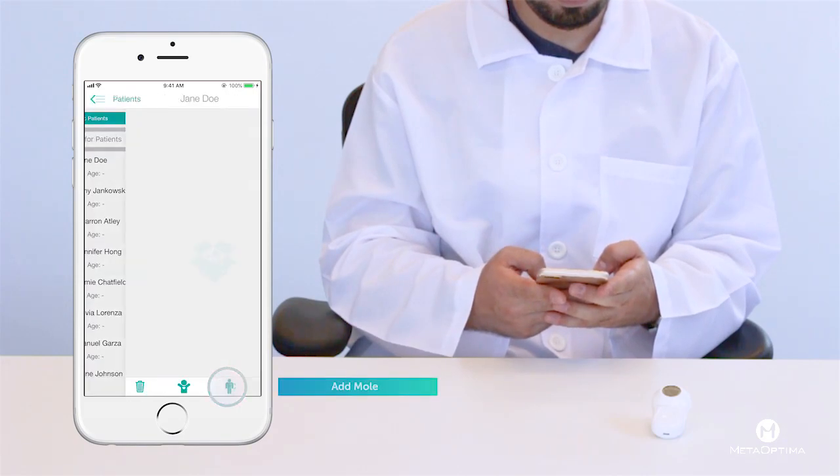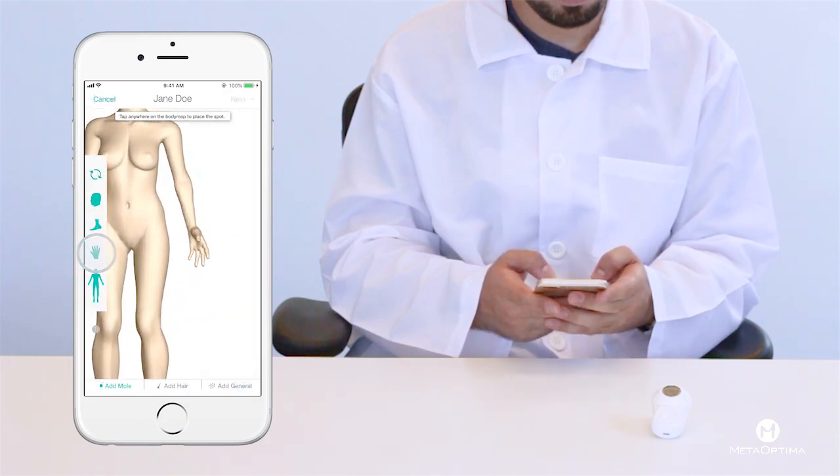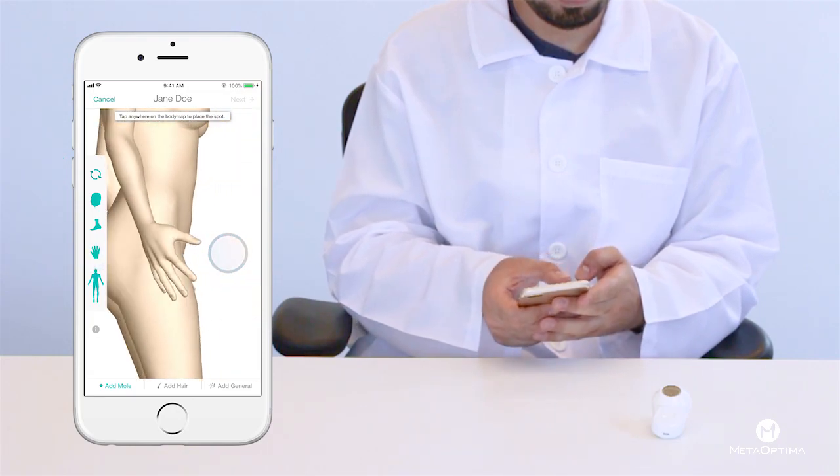Simply press the add mole button in the bottom right corner. You'll be taken to a 3D body map. Move the body by tapping the body icons or dragging, and place the mole by tapping.